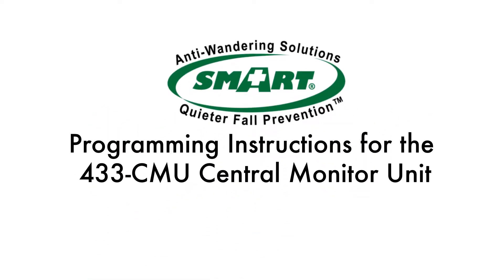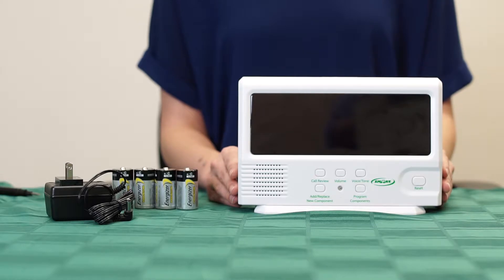Stay tuned after this video to see individual component programming. Hello and welcome to Smart Caregiver Programming Instructions for the 433 CMU Central Monitor Unit.